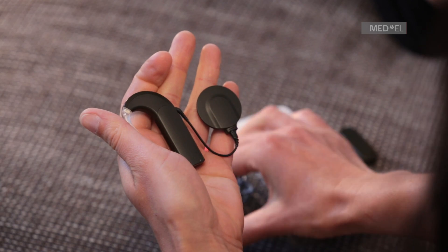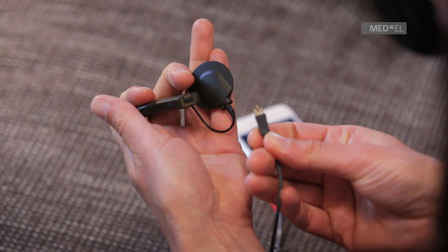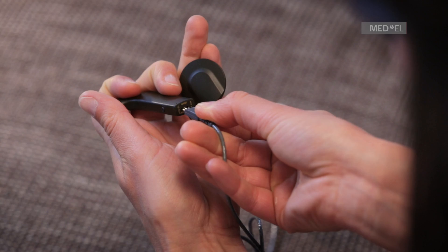Insert the 3-pin plug of the audio adapter cable into the FM port and the 3.5 mm plug into the headphone port of the audio device.